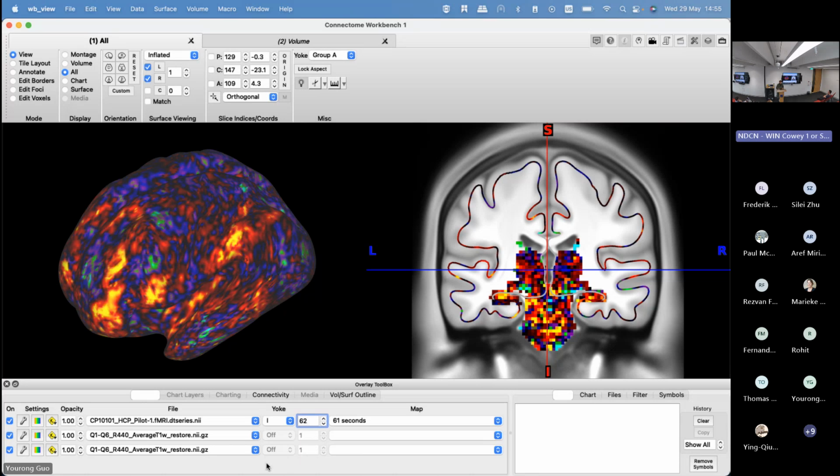It's the time series data with 1,000 time points. You're asking how it's projected? Yeah, so what if there are two voxels, for example, in the range? I'll show it later with the command. But basically, it's a weighted sampling measurement. So you can resample it inside the cortical region. But I'll show it later in another command.